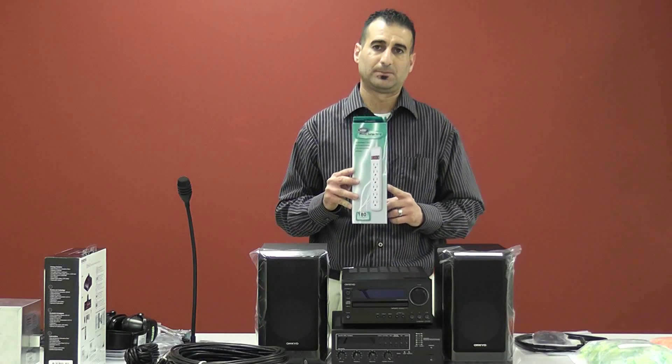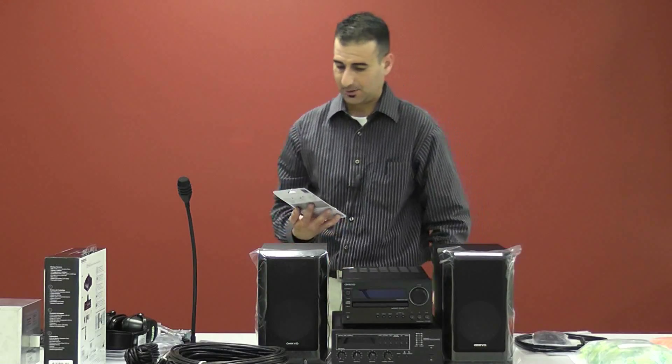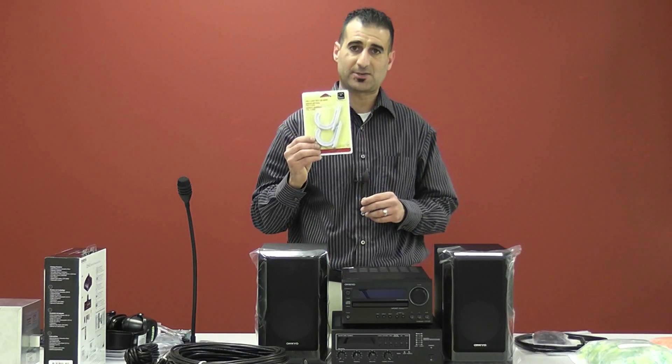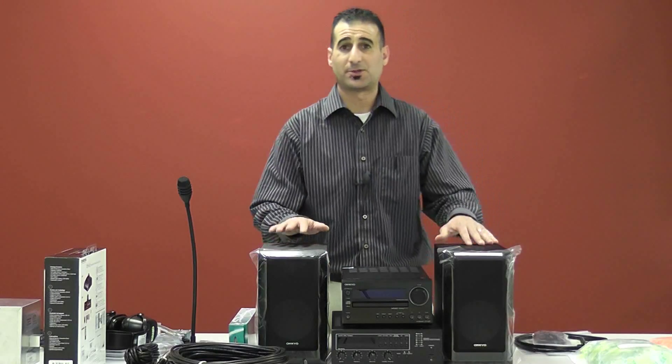We also supply a power strip for additional power outlets if needed. Last but not least, we have our headset hooks — when the headsets are not in use, you can hang them on the hooks. That concludes the full sound system.